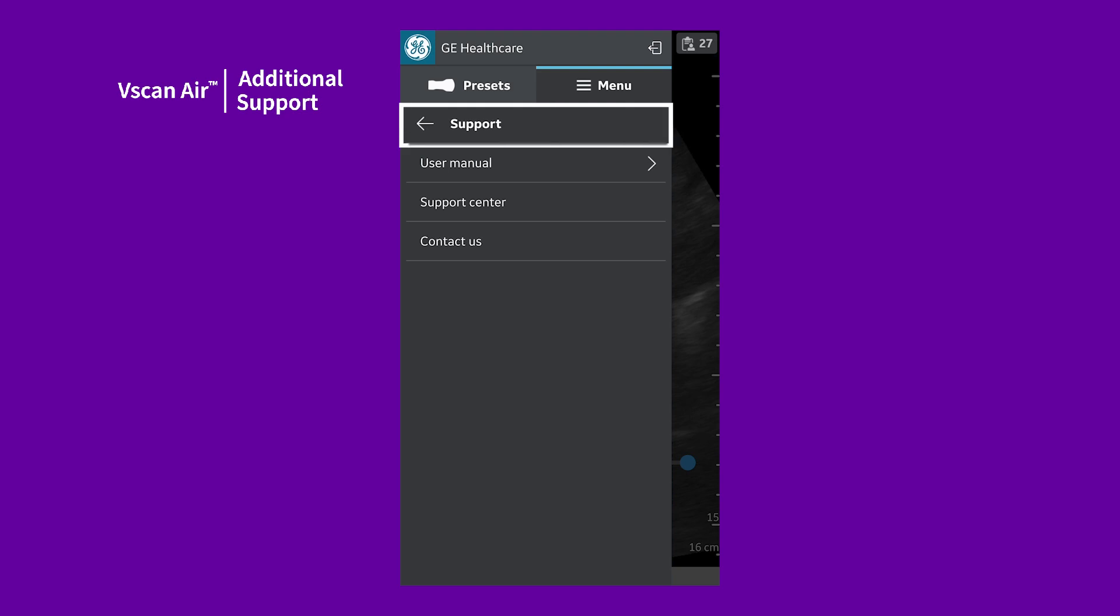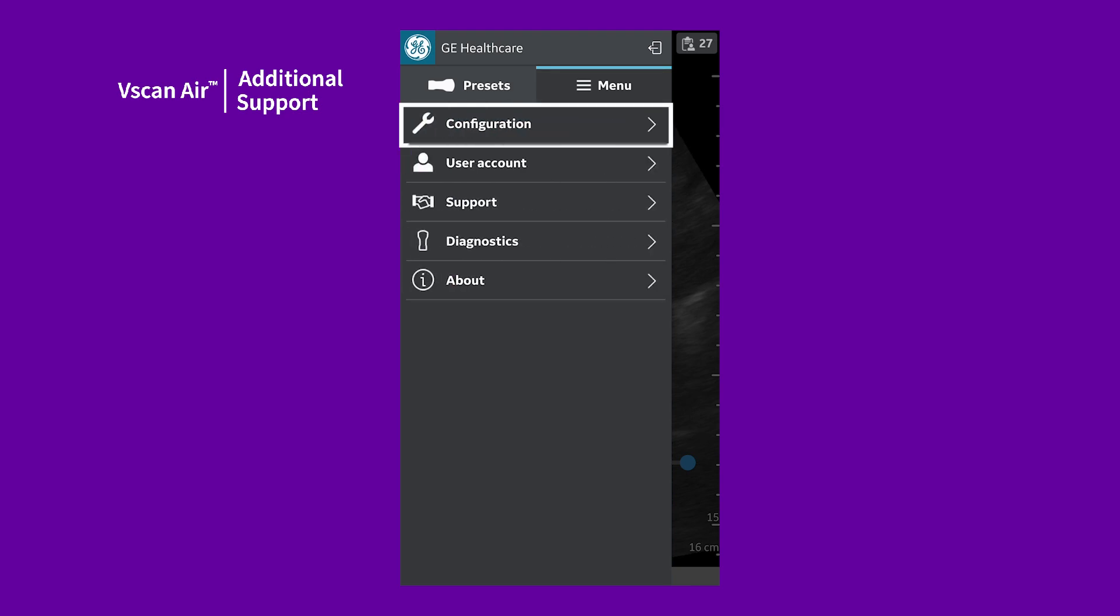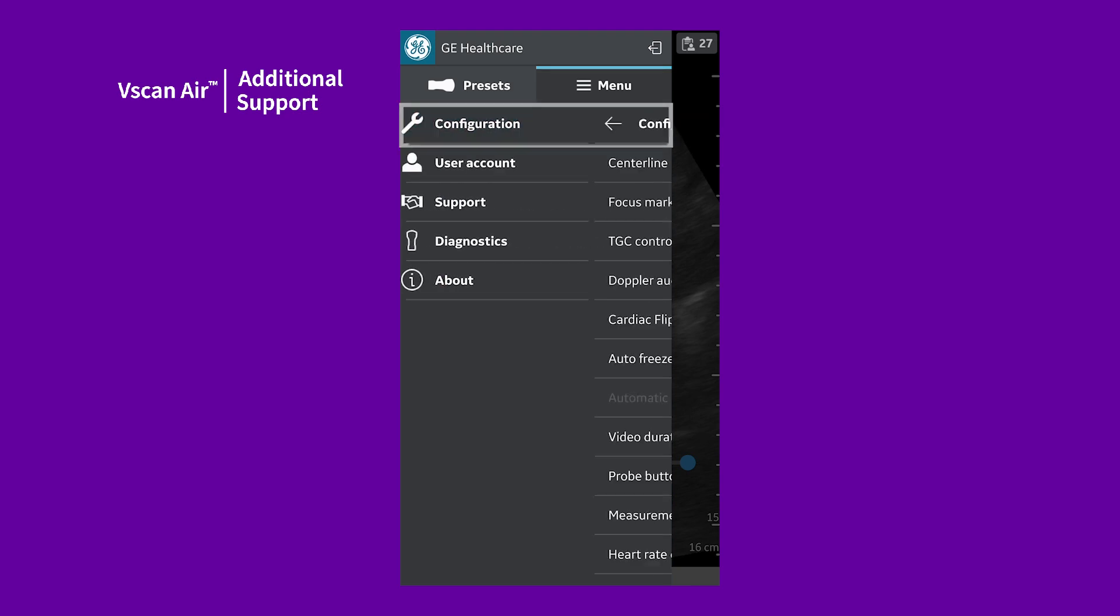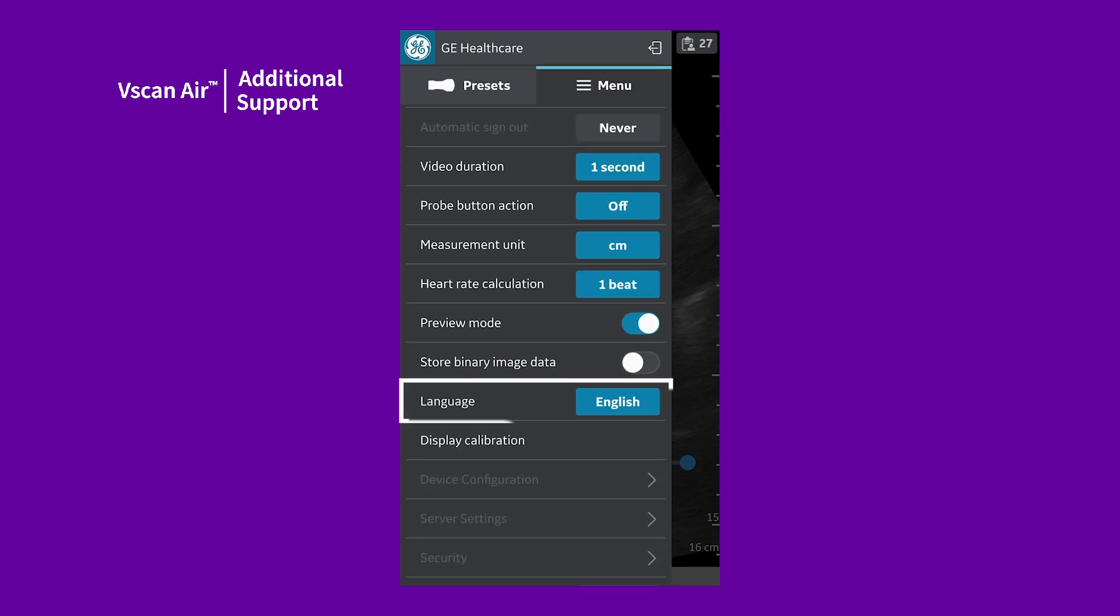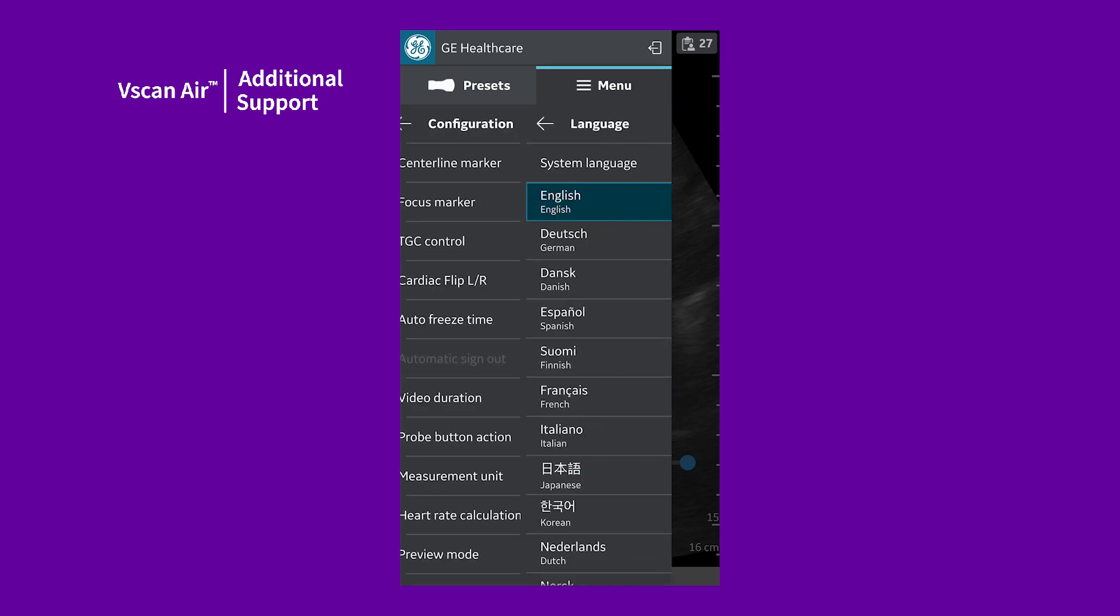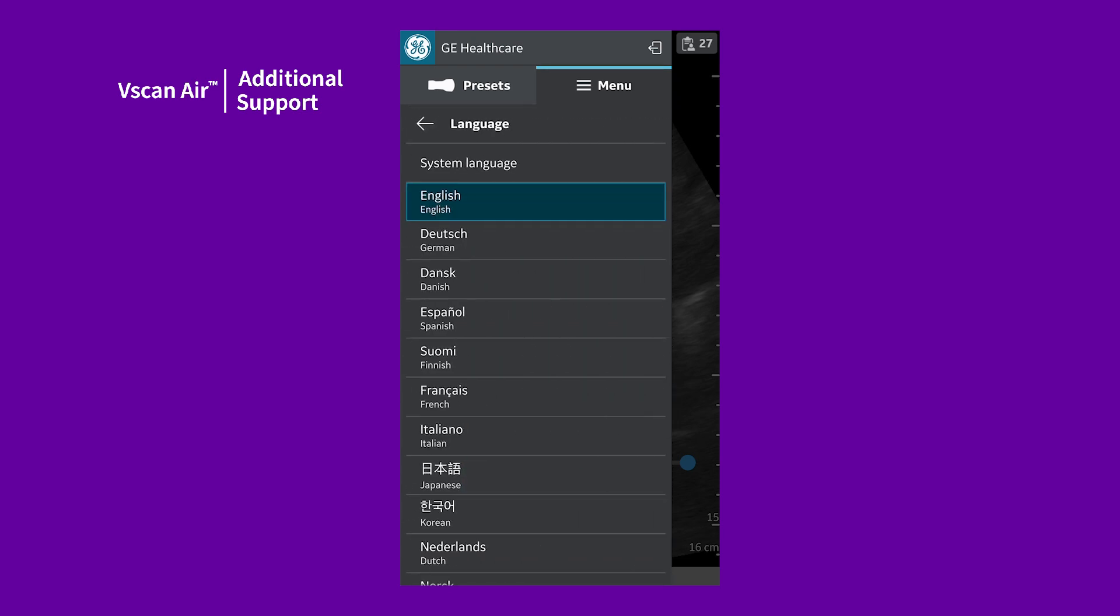To change the language, select Language under Configurations and then select a specific language.